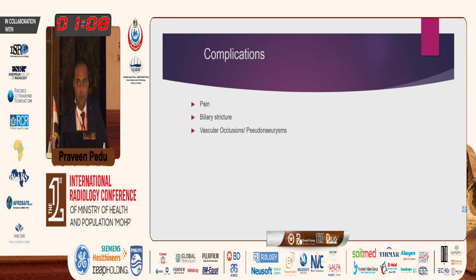Now, IRE is not devoid of complications. Any procedure which involves placing needles inside the liver can cause complications. Pain can be a problem because you cause a lot of edema immediately after treatment. You can minimize that pain by giving the patient some steroids that can reduce the inflammatory response after the treatment. So that is something which can be managed.